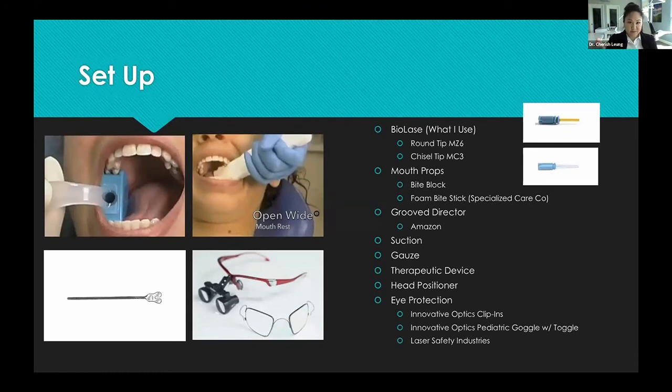And then therapeutic device or papoose for your older kids. Now, I don't use papoose in my practice except for these procedures. And so it just depends on where you're located and how accepted it is. But for me, therapeutic device on toddlers is much better because parents can't hold them while you're doing this and their heads get in the way when you're doing the procedure. On newborns, completely different what I use, I'll show you.